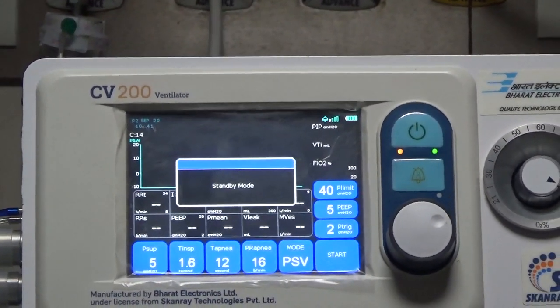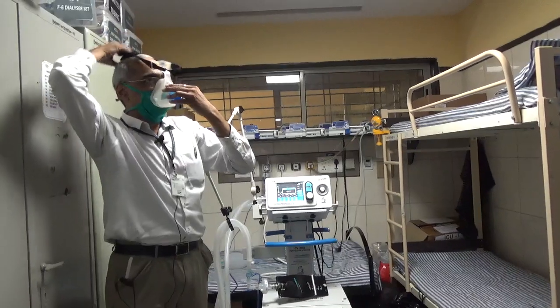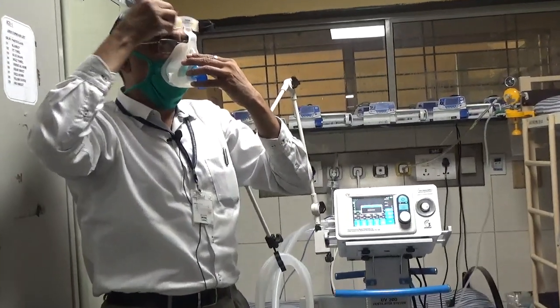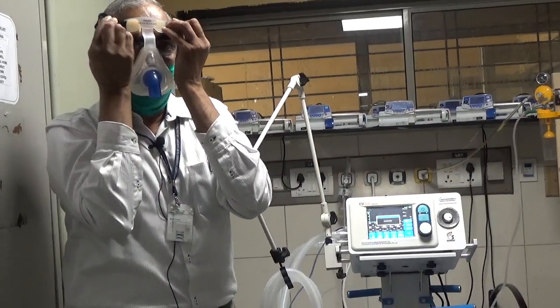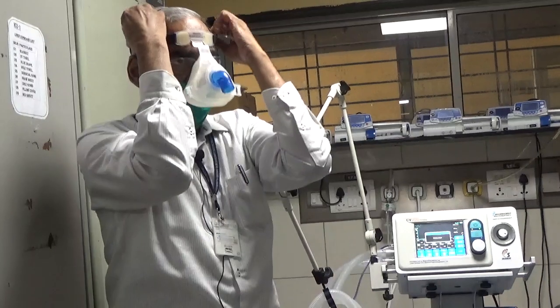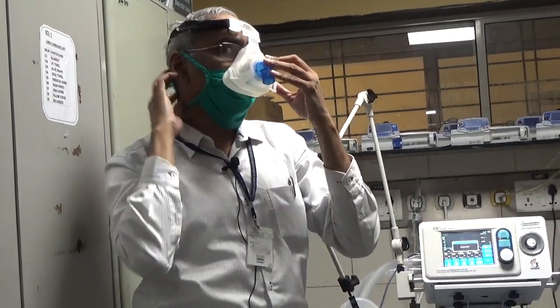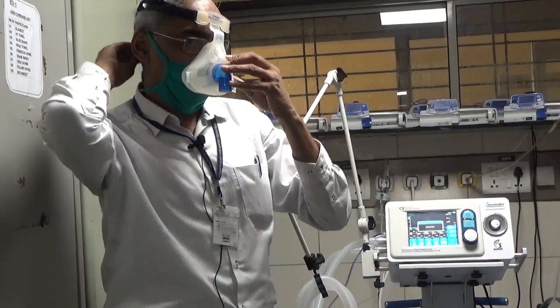Okay, so now I've told you about how the mask is applied. So mask is placed tightly on the face. The strap is taken from behind. It is placed like this. And then using these two, you have to tighten both simultaneously. And then once you take it simultaneously, you tighten it. Once that is done, then the lower straps need to be fixed. Usually you will have an assistant required for this.